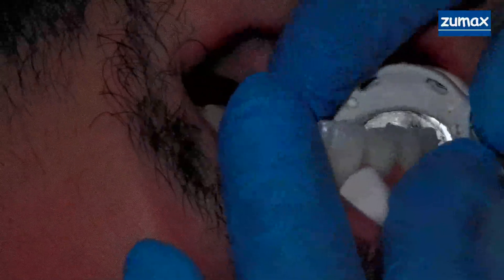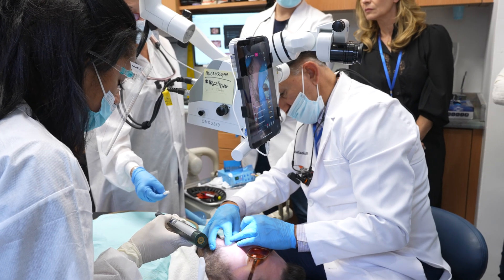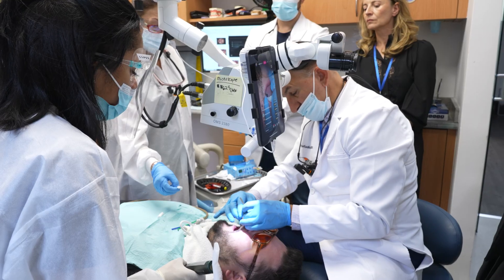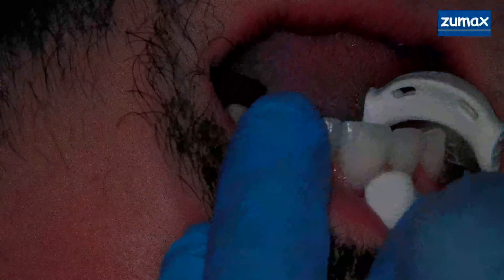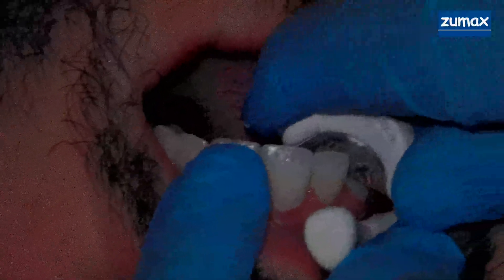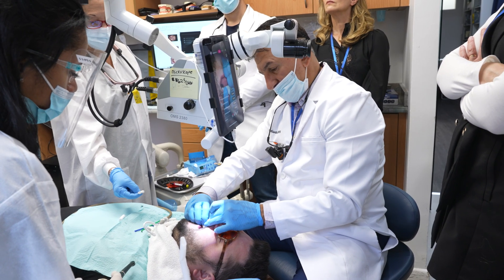I'll do it again with the full cure. I don't want any interproximals on the premolars — it's really hard to get through. One more full cure on the back one. Full cure on the next one. Full cure on the canine. Full cure on the lateral. See how they're getting stuck even though I did all that work? That's because interproximally the cement doesn't really tack 100%, so I want to always go back and really get a good seal with the final cure.